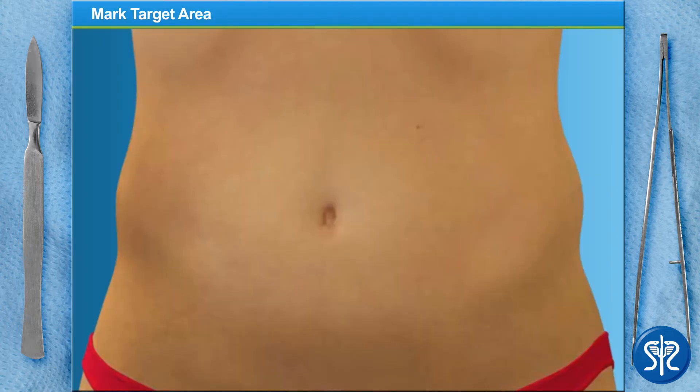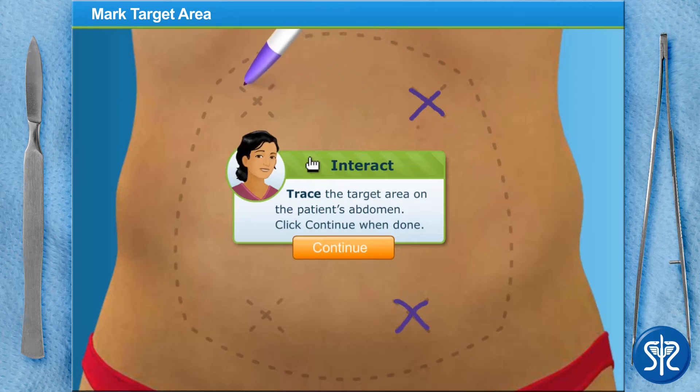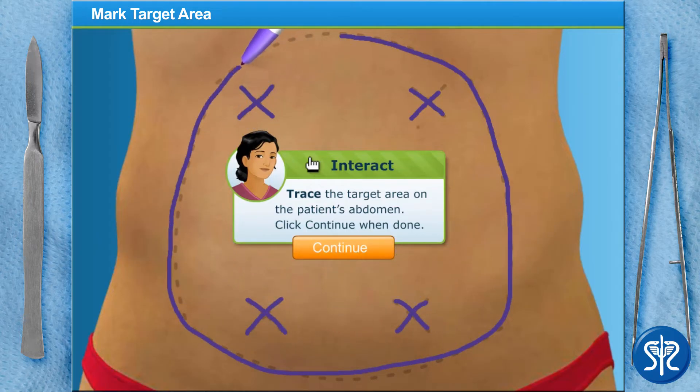The first thing we need to do is mark the target area. This provides our patient and ourselves with a clear idea of where we'll be removing fat deposits. Why don't you give it a shot? That looks great!